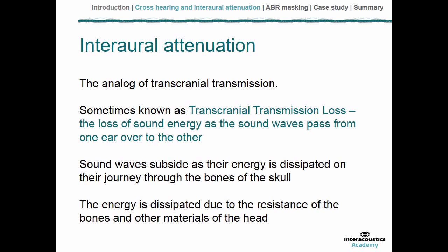So that's a little bit about bone conduction. The main take-home message from our point of view, of course, though, is that sound can be perceived by bone conduction. Now I'd just like to mention a new term, a new phenomenon. That's the one of interaural attenuation.